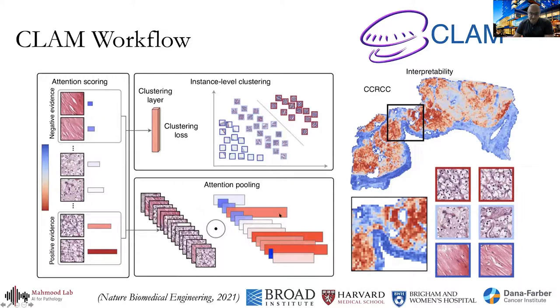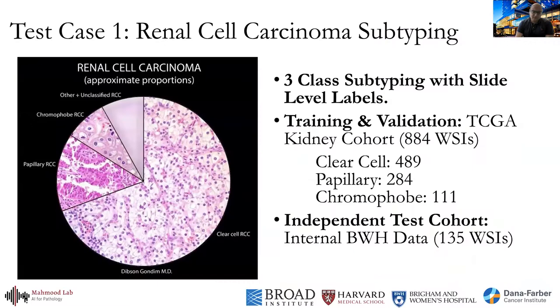And then towards the end, it's interpretable, so you'll be able to get slide level interpretability. And then there are some additional bells and whistles that you can use to get further semi-pixel level or cell level interpretability as well. So we tested this with a number of different problems. We tested data efficiency. So I'll talk about a few of those here.